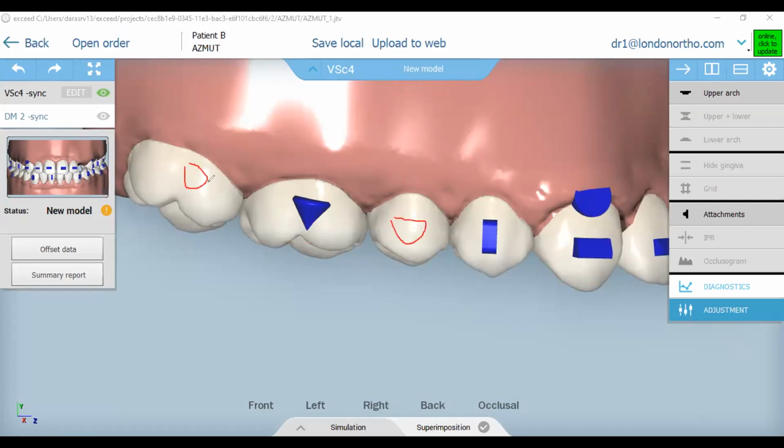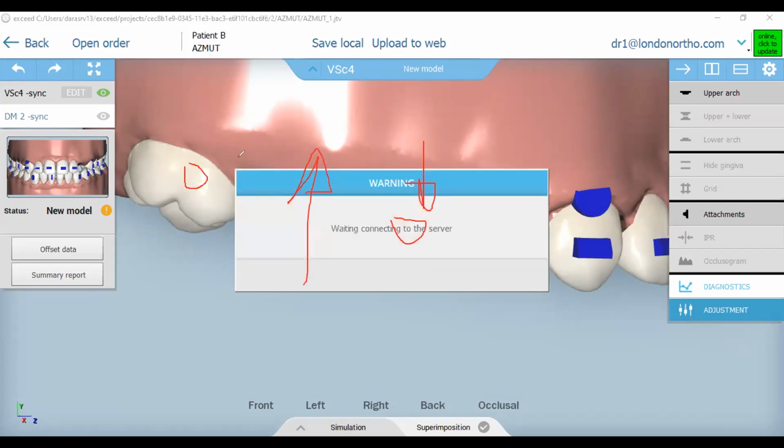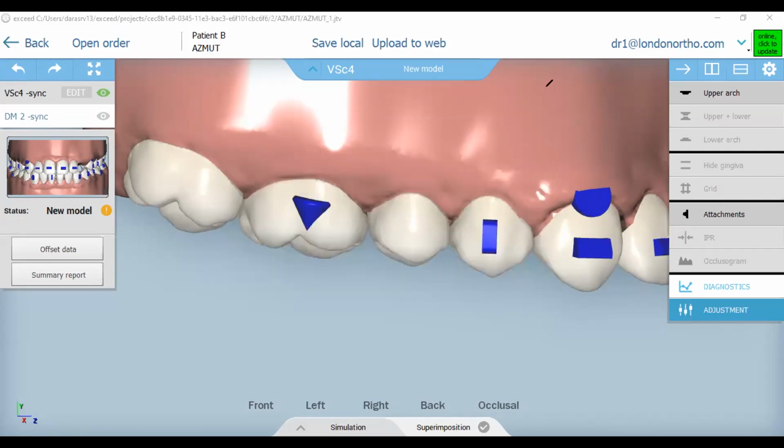I prefer if I have the possibility to put it in those two adjacent teeth. This means that that liner will just squeeze there very tightly and will apply a lot of force into this tooth and is not going to be able to pop out because we have those retention attachments in there. So, this is just a quick share of how we can use those attachments and why we want to use them. Just the last 2 points before we finish.